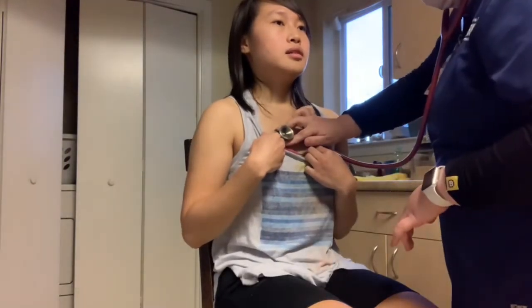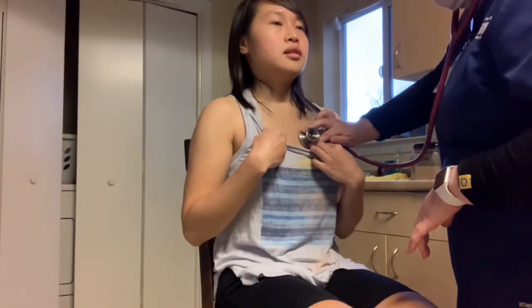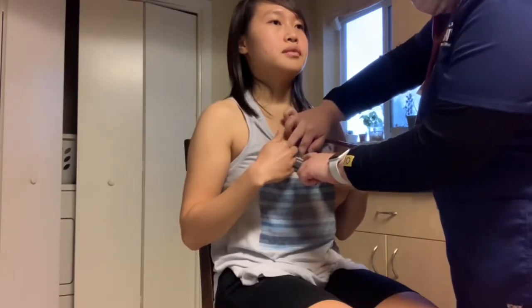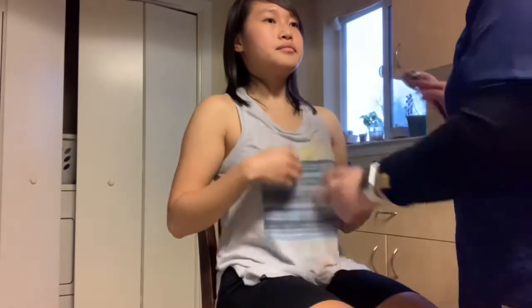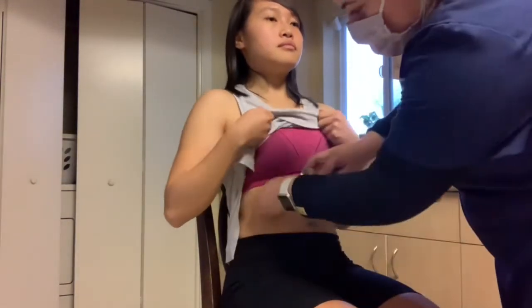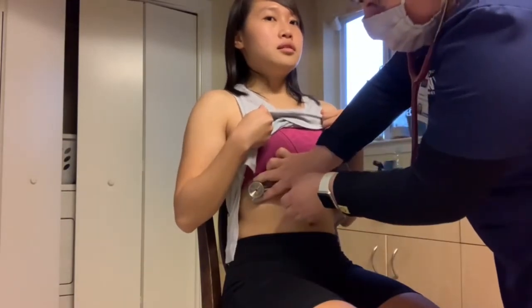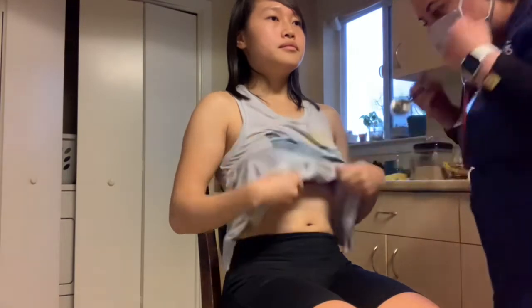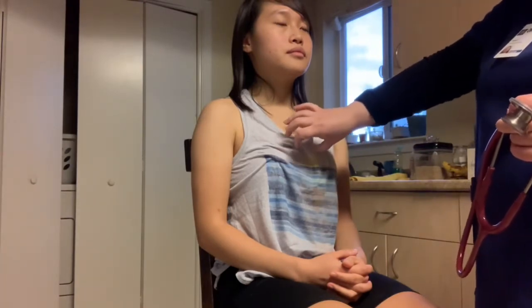So I'm going to have you take a deep breath every time you feel my stethoscope touch your skin, okay? I'm going to have you lift your shirt. And one more time. Okay, so on the front, she has bronchovesicular breath sounds more centrally or medially, and then as we go laterally, she has vesicular breath sounds. Her lungs are clear to auscultation with no adventitious breath sounds.